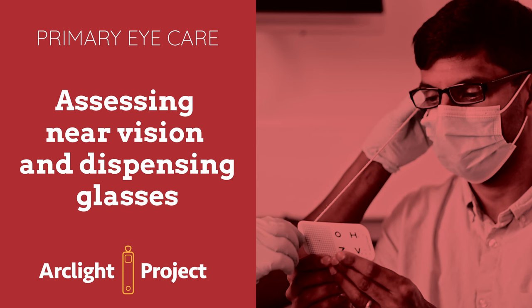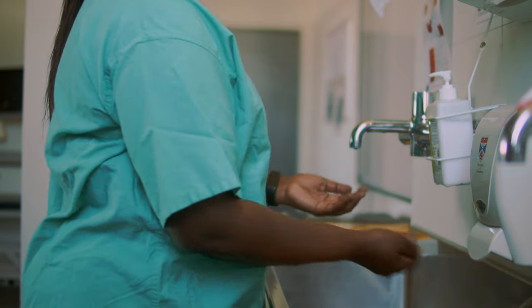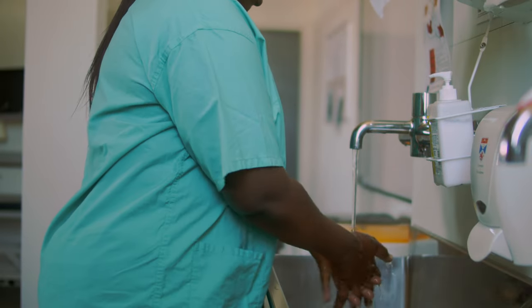This video demonstrates how to assess near vision and dispense glasses. Wash your hands and don PPE.